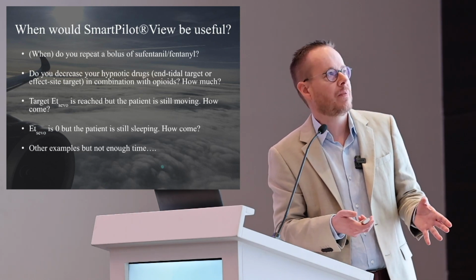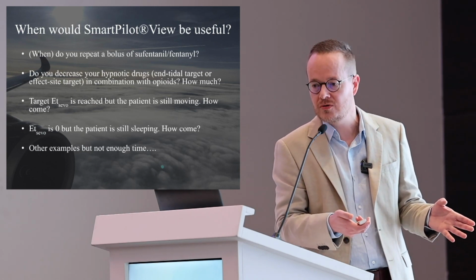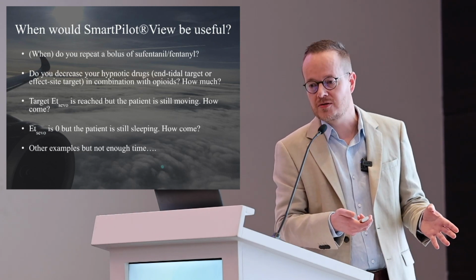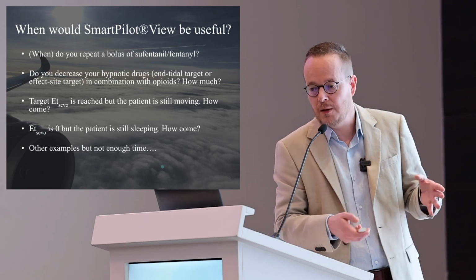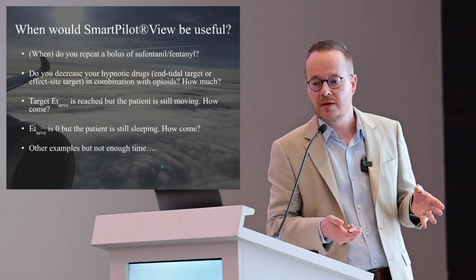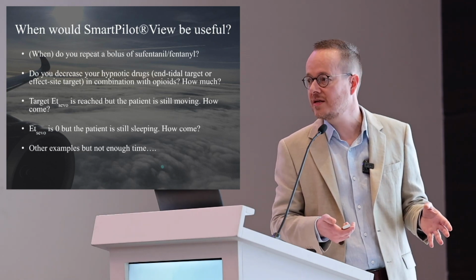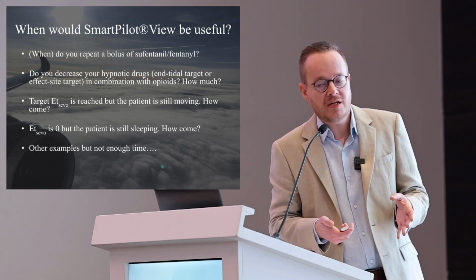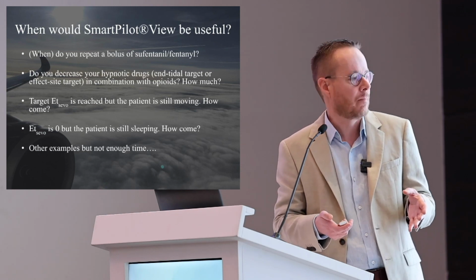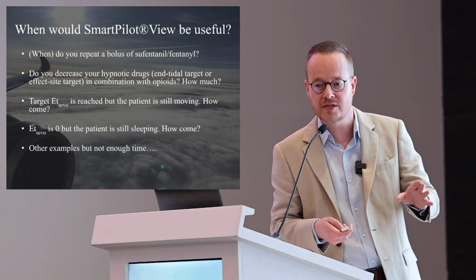So when would SmartPilot View be useful? It would help us to give or not give an extra dose of opioids. It would help us to decrease our hypnotic drugs, and it would help to steer us how much we can do that. It would help us to answer the question, how come my patient is not waking up and my end-tidal is already 0? How come my patient is still moving and my end-tidal is 1.3 MAC? There are other examples, of course, that I will be happy to discuss with you, but we have to stick to the time.